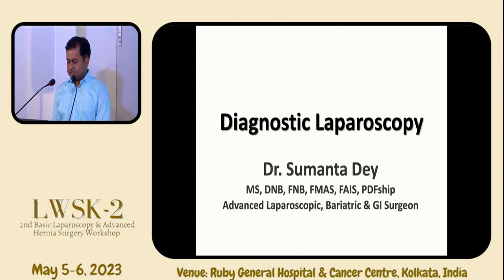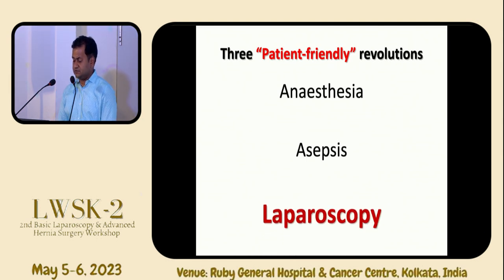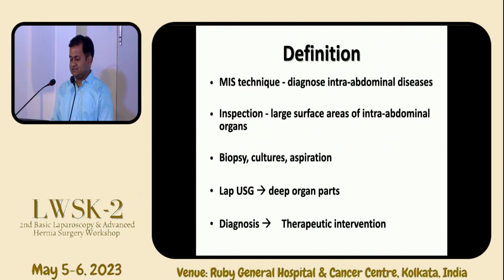If we consider the three most patient-friendly revolutions in the field of laparoscopic surgeries, number one is anesthesia, number two is asepsis, and definitely number three will be laparoscopy. By definition, it's a minimal invasive surgical technique to diagnose intra-abdominal diseases. So what can we do by doing diagnostic laparoscopy? Inspect the large surfaces with the intra-abdominal organs, take biopsy, cultures, do aspirations, do a lap ultrasonography in deep organ parts if you have the facility, and definitely do therapeutic intervention if you know the diagnosis.